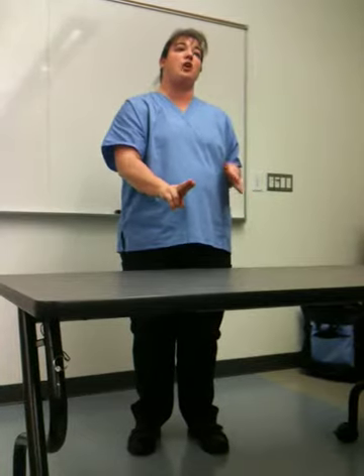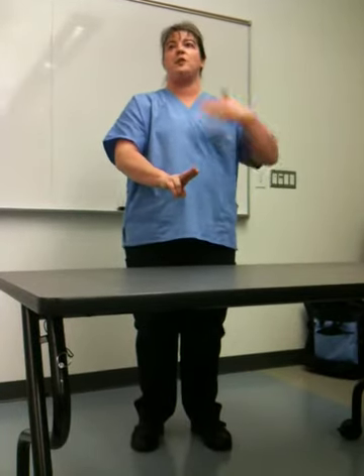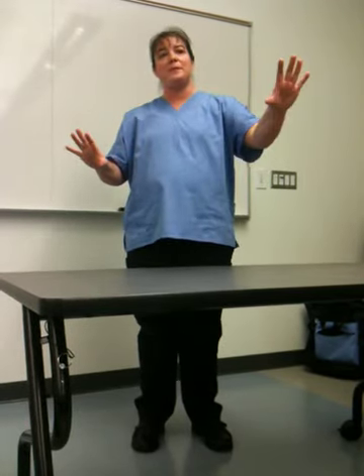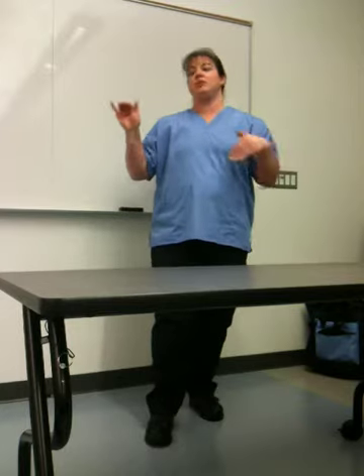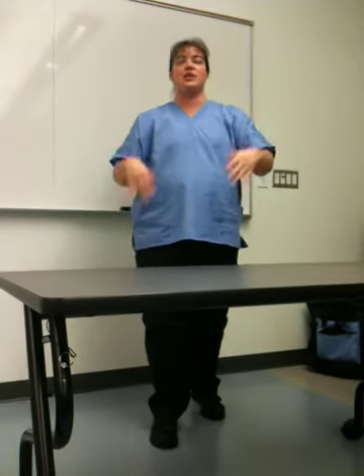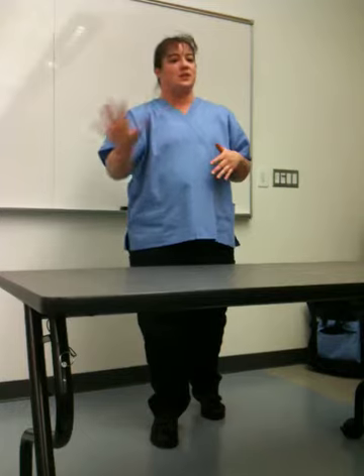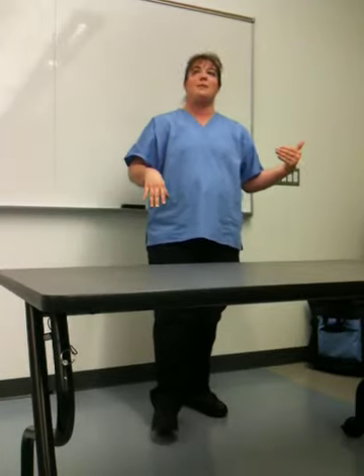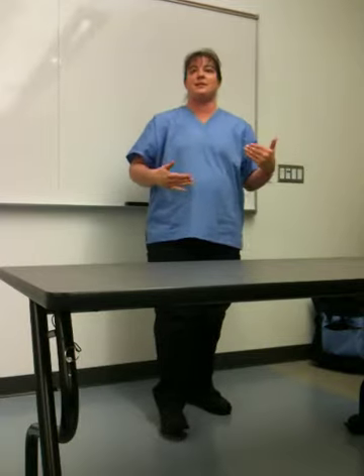So am I feeling an artificial pulse being created by those compressions, and are they at the right rate and the right depth? Then 2 minutes has gone by. Stop CPR, we're analyzing now, stand clear, and we get a shock advised. Stand clear, shock, back to chest compressions, ventilations. I'm going to continue to make sure the compressions and ventilations are adequate and continue without any prolonged interruption. I want to get the information from my EMT who was talking to the crowd, talking to the bystanders, and see if I can get a basic SAMPLE history.